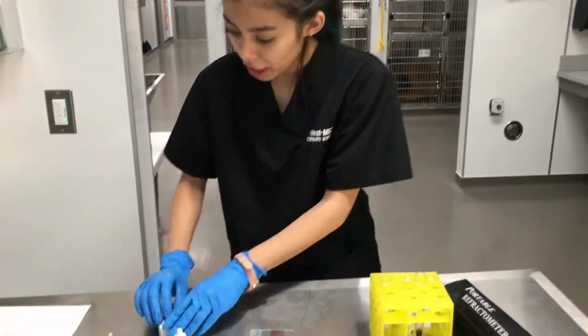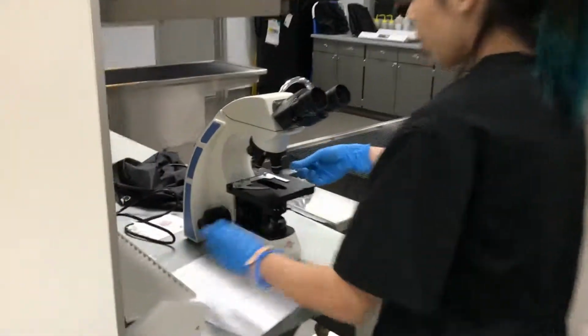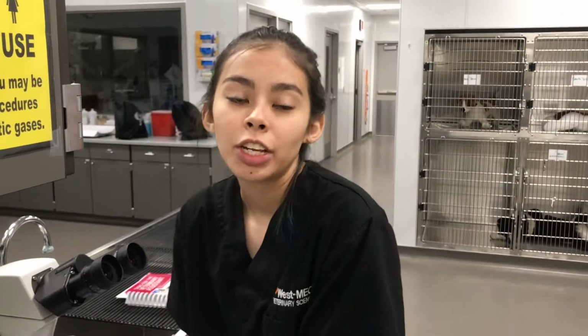Okay. And once I'm done with this, I will take the patient's urinalysis record and its microscope slide and put it right next to the microscope for the veterinary technician or the veterinarian to examine it. And this is how you do a urinalysis.